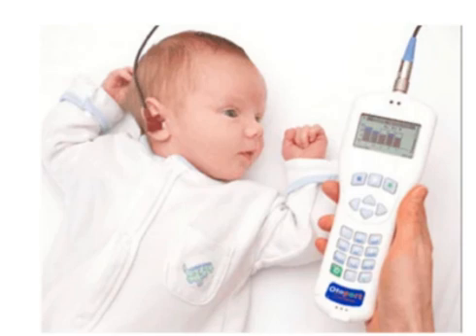Ototoxicity monitoring. Over the last decade, OAE has been increasingly used to monitor the ototoxicity of medications, particularly aminoglycoside antibiotics and platinum-based chemotherapy agents. Ototoxic drugs affect the outer hair cells and are detectable on OAE before a conventional audiogram. Its quick application and cost efficiency make it a good clinical choice to follow patients during their therapeutic course.